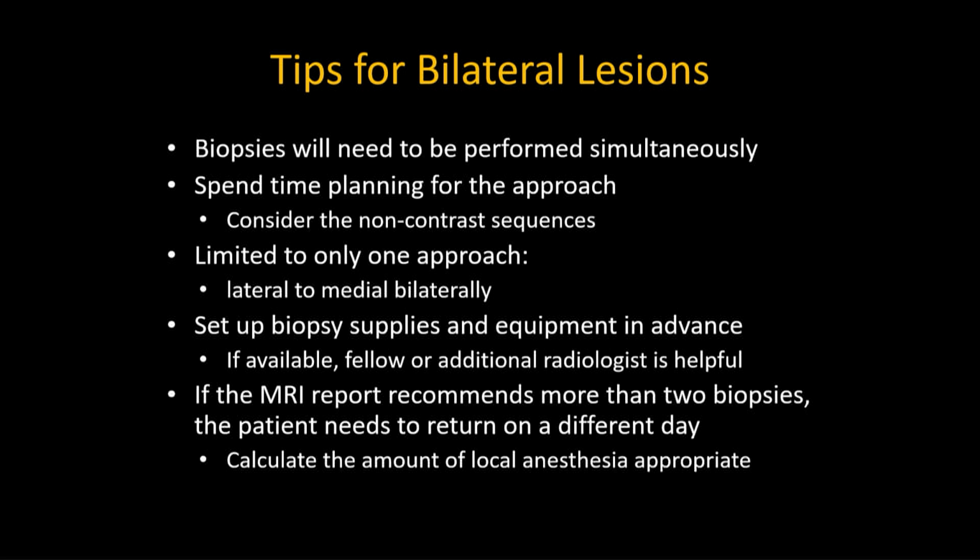But also remember that there is a lidocaine maximum dose for patients, and so if you have more than 2 biopsies for a patient, calculate that lidocaine dose, and they may need to come back on a different day.